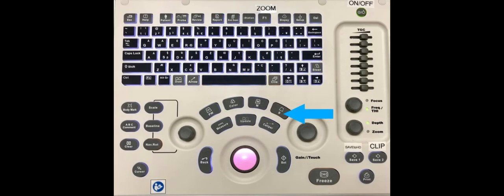The B button accesses B mode. This is brightness mode, and this is the standard default setting for the machine when scanning. The M button accesses M mode, and this is sometimes used in both cardiac scanning and also lung scanning.